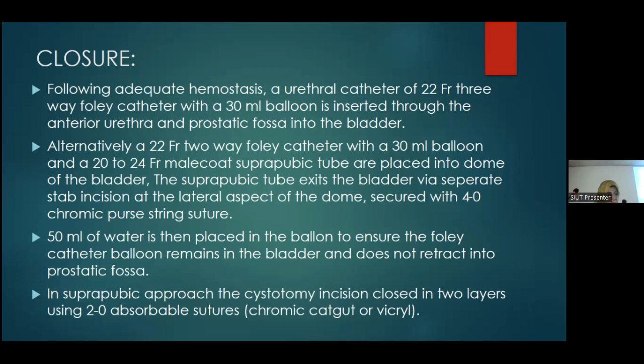You see a long list of maneuvers for hemostasis and applying stitches over the prostatic fossa from all the sides, anatomically from where the blood supply and venous drainage are coming. But in the technique usually observed in OTs here and there, everything is blind. Nobody thinks of applying sutures over bleeders, but relies on the pressure applied by the Foley or by packing so that hemostasis can be secured. This is not surgery.